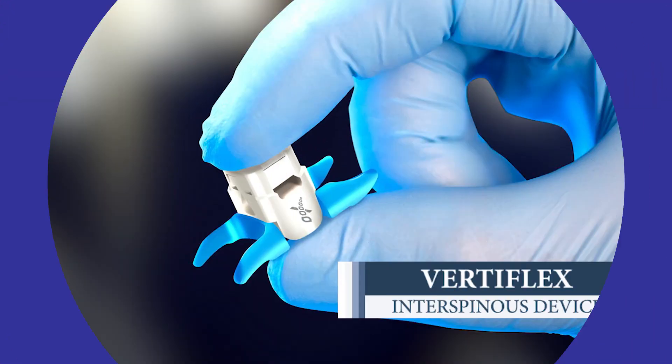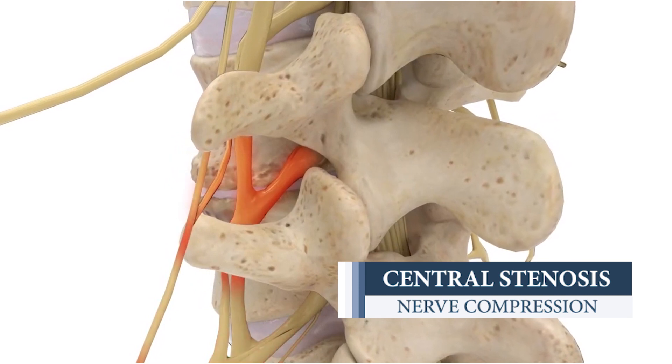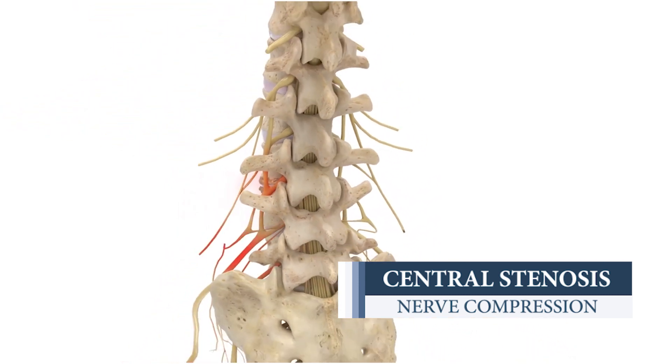Vertiflex is another device within the family called interspinous devices. Vertiflex is used for central stenosis. Patients who present with back pain and pain shooting down their legs.